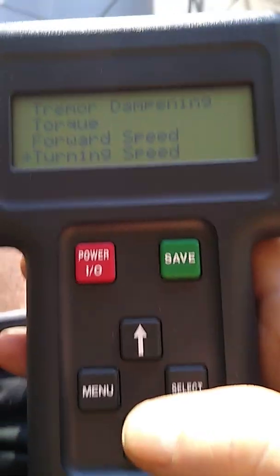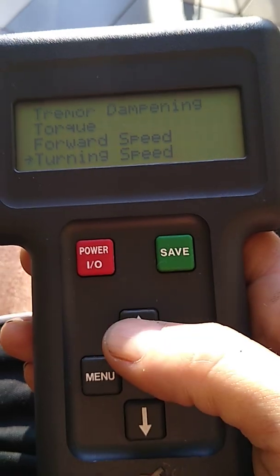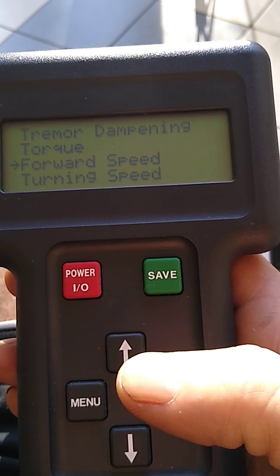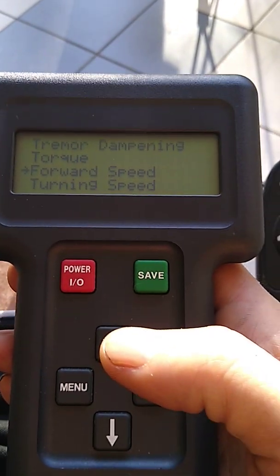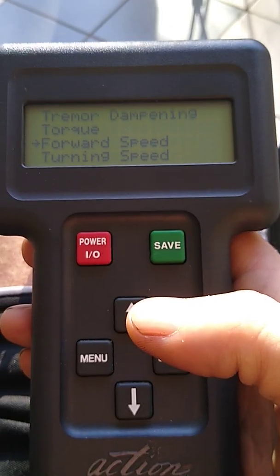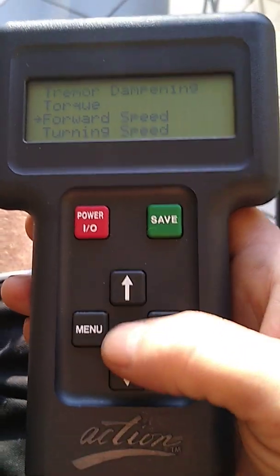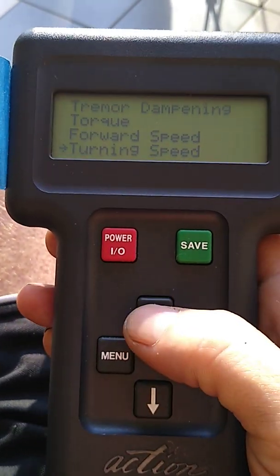This chair was set at 90% forward speed from the factory — almost at top speed — but acceleration was set around 40%, and the turning was similarly limited. I'm going to show you what it looks like going from those factory settings to a reasonable, more optimized configuration.